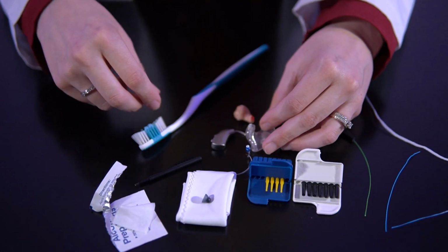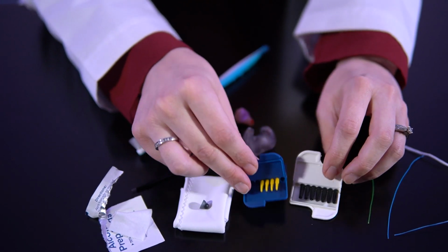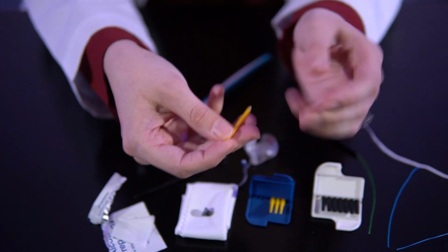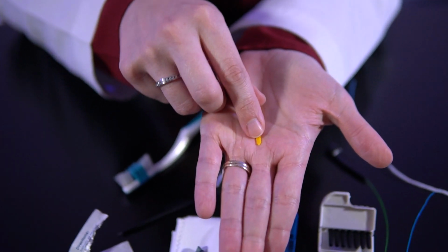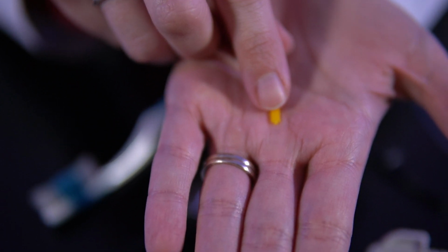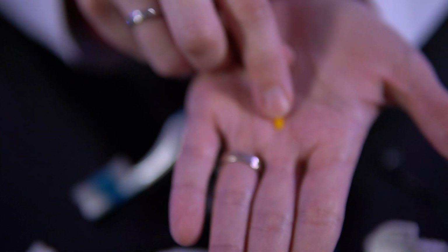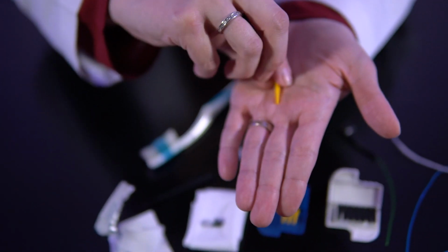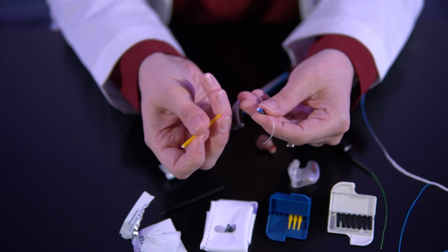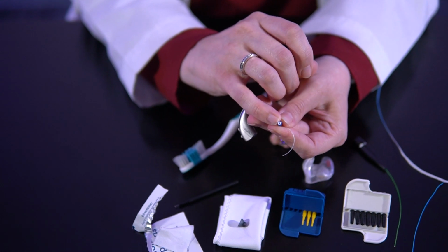And then what we're gonna do is we're gonna grab our filters that go for our hearing aid. And I'm gonna grab this yellow one. So on it, on the tip, there's what I call a braille dot. And that's the part that we're gonna put in the hearing aid to remove the old one out. Now, if that's too hard for you to see, or you have a hard time feeling it, and you're not comfortable with that, you can also just use your fingernail and pop this filter off right here.